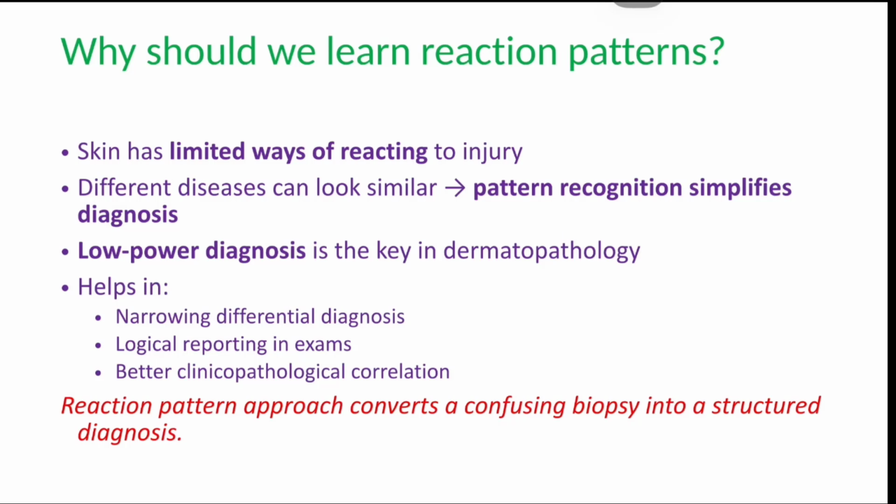So, if the checklist tells you what is present, reaction patterns tell you what it means. Now, let's apply the Weedon Ackerman pattern based approach and make skin biopsy systematic, not confusing.